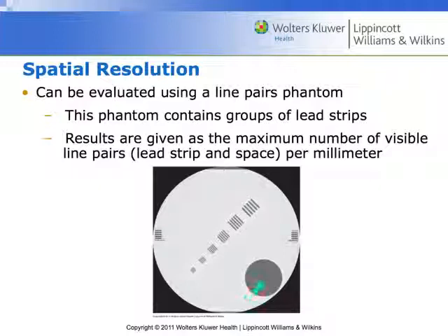This dot here is going to be like a baseline kind of thing. So we may do baseline ROI placements out here in the water as well as right here, right? And those will give us a baseline. Was the scan initiated with appropriate technique?